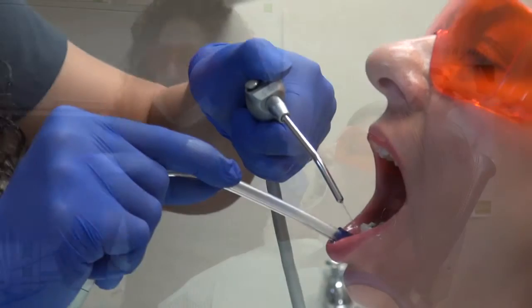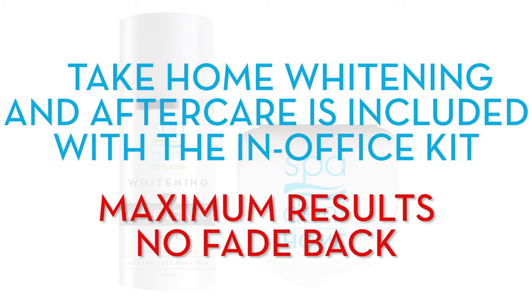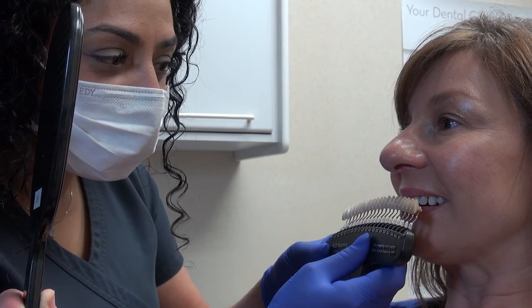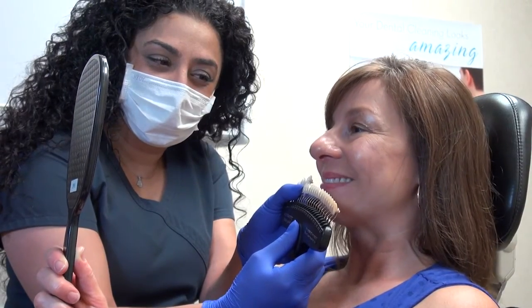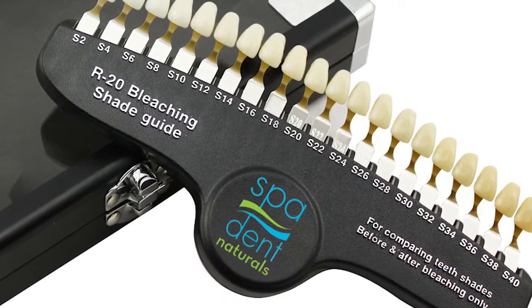Remove the tray, suction, and rinse. Remember to place the tray in the patient's take-home case. Take another shade guide reading with your patient to show them their healthier, brighter smile. Remember, with the SpaDent bleaching shade guide, each tooth represents two shades.